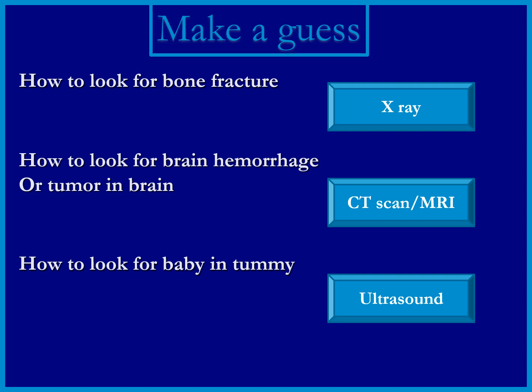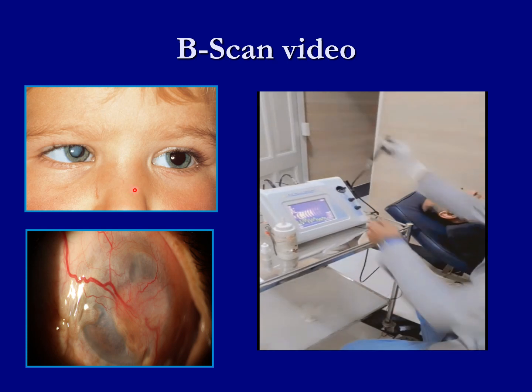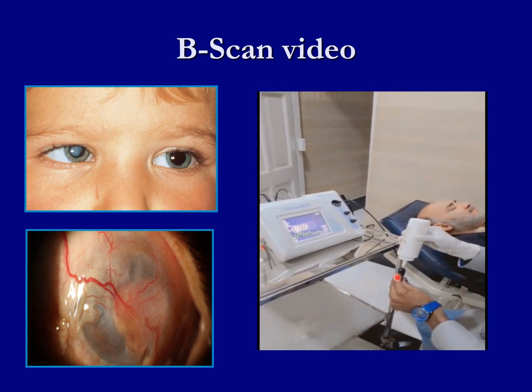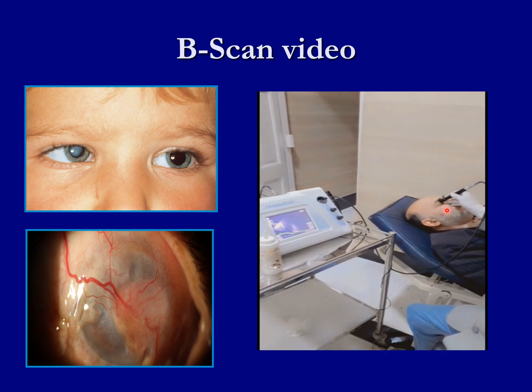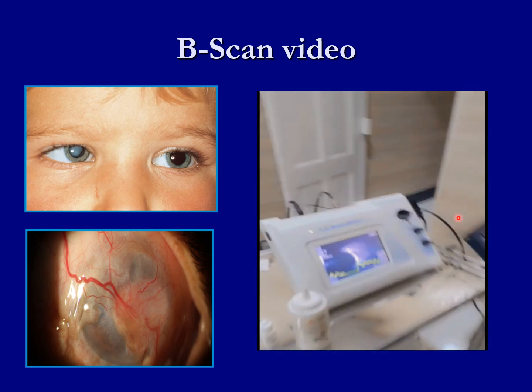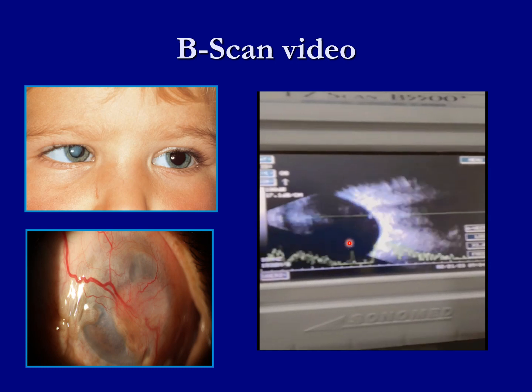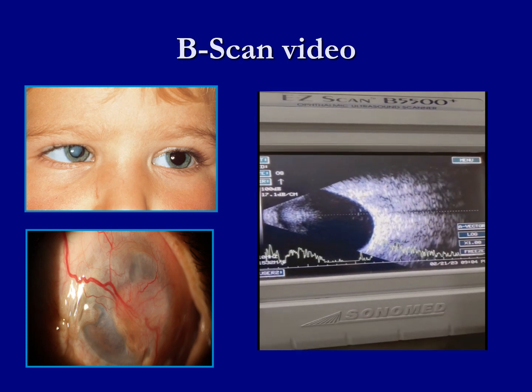So we have to find a way. Similarly, in ophthalmology, if the patient has got a cataract or opaque cornea, then you cannot see the retina. So to see the retina, we use the B-scan or ultrasound waves. This is the transducer, the black one. We are putting some gel on it and seeing the picture — you can see the eye. This is the retina and it is attached. And that is the optic nerve. So you can visualize the back of the eye without actually being able to see it. We call it a B-scan.